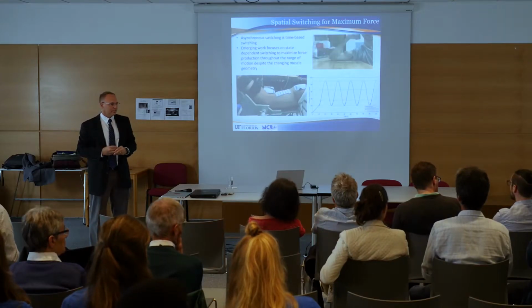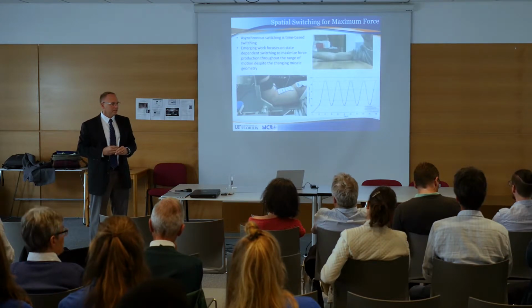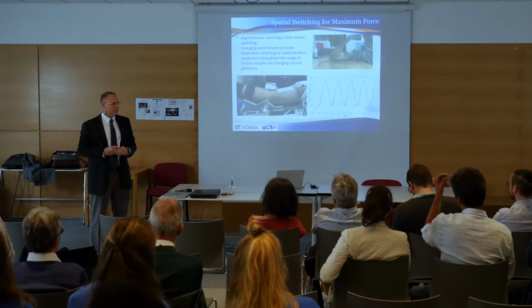Could you make a brief comment on how you were selecting the electrode position and the electrodes themselves? Because when you do a distributed stimulation, you can place them anywhere on the muscle, and you obviously were selecting them for a reason. So in order to make the comparison as fair as possible, we took the one large pad for conventional stimulation and we drew on the person's leg an outline of that shape. And then when we put the smaller electrode pads for the different channels, we put them within that same space so that we could eliminate variations, like you're grabbing more surface area and maybe that's causing an effect. But you're exactly right.